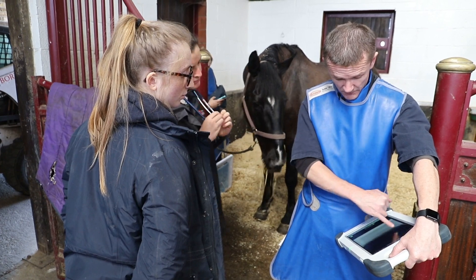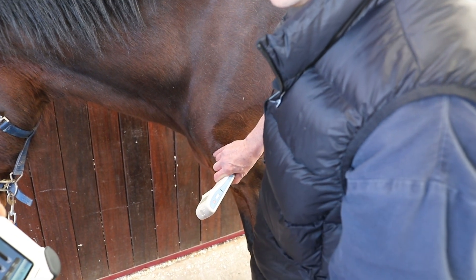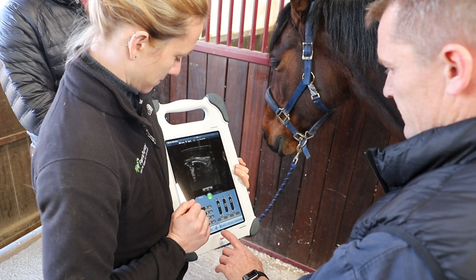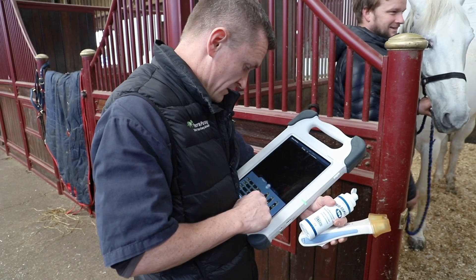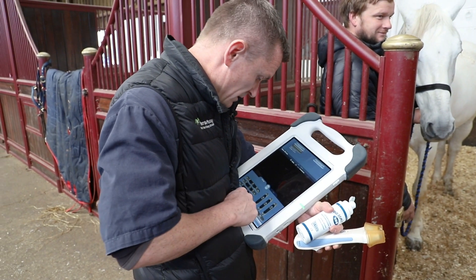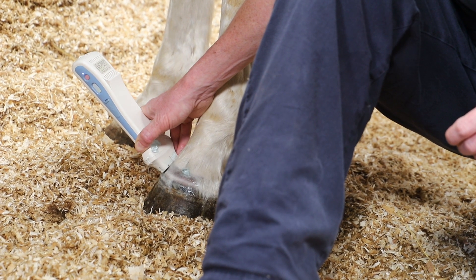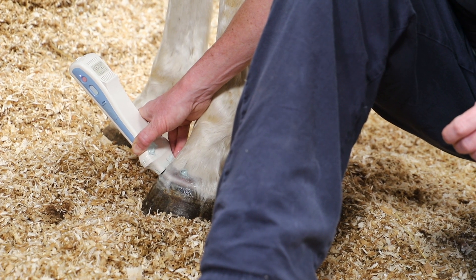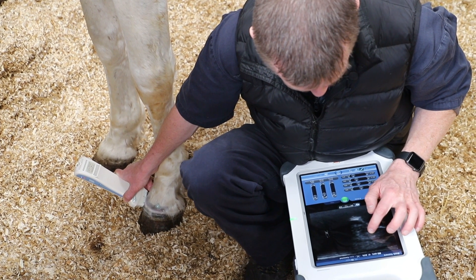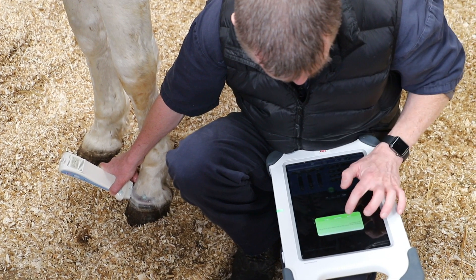We also have the SonoSlate, which is another great thing — you can switch between X-ray and ultrasound at the same time. Image quality is absolutely brilliant, no lag, nice and portable. Clients absolutely love it. It's a real selling point — not many practices are able to come out, do X-ray and ultrasound all within half an hour, no wires, no complications, get the images straight to you. It's been a big financial generator for us and has gained us clients as a result.